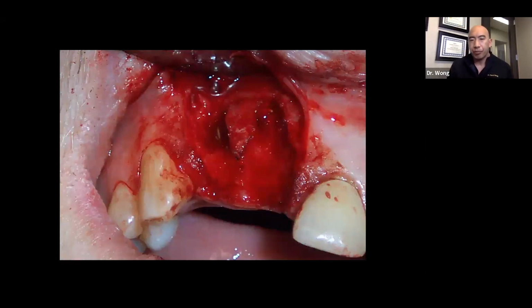Number 1 is you took out a tooth and it had a blown out facial plate. You knew there was communication from the outside of the socket to the inside of the socket, but we chose just to fill the hole with bone anyway. Just plugged a bunch of this powder into the socket and expected bone to grow. Well, it doesn't work that way. When you don't have 4 walls of bone, you can't just plug the hole with bone.